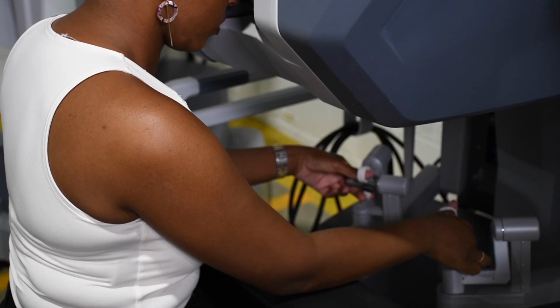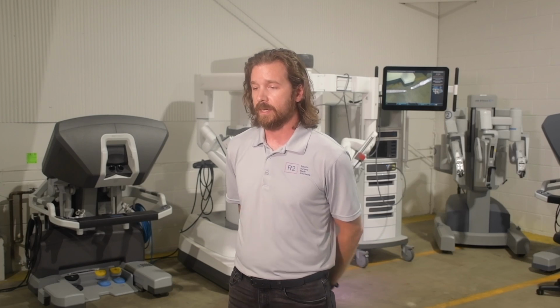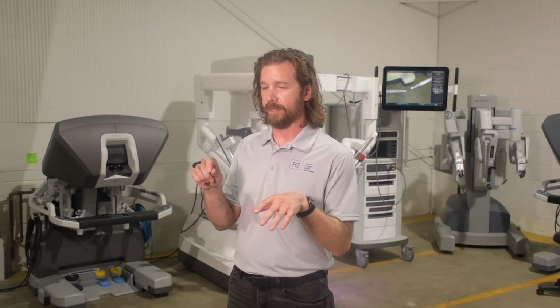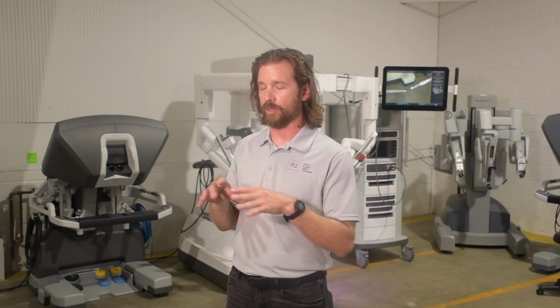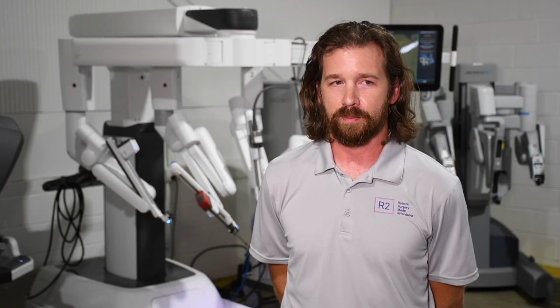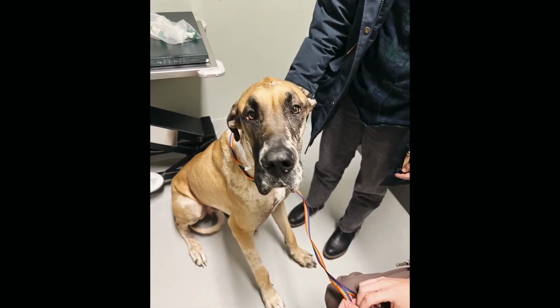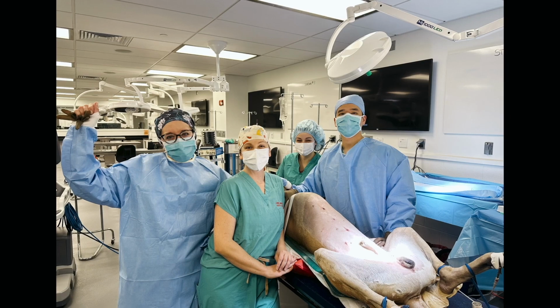The go-to fear is that robots could take jobs, but as founder Schrader says, they're meant to assist in ways humans cannot, helping make and keep pets and people physically well. Instead of one large incision, it's smaller, multiple tiny ones that heal a lot faster. And the whole goal of the minimally invasive surgery provided by the robots is so that the patient can heal a lot faster. That's how they're contributing to, I guess, the overall wellness of patients.